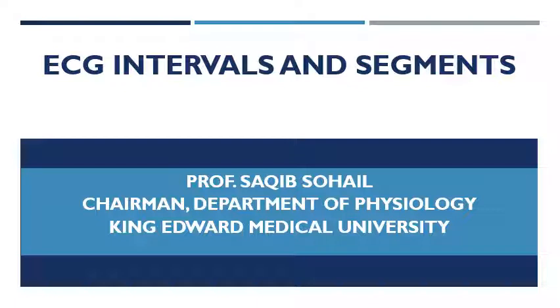This lecture is about the intervals and segments of ECG and their clinical importance.